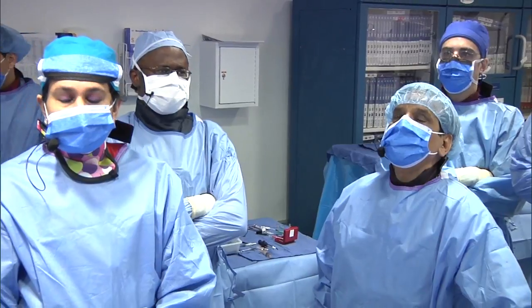Okay, Alan. I think this is an excellent example as we've moved away from inoperable patients, and then as a collaborative effort decided that these are cases that are reviewed by our surgeons, Ani and myself, reviewed by Dr. Sharma and Dr. Kinney, and we decided this is what I think is best for a heavy patient like this. We could operate on this lady and get her through the operation, but she's not going to progress all that well. She's at high risk for a sternal wound complication, respiratory failure, and pulmonary embolus, so it's not something as surgeons we're thrilled to operate on. This is a great example of a patient that we review together and find is best served by a TAVR, and she's had an excellent procedural result. Now we'll focus on excellent post-care management, get her out of the hospital, mobilize quickly, and I think she'll really progress well, and it shows the advantage of this new emerging technology.